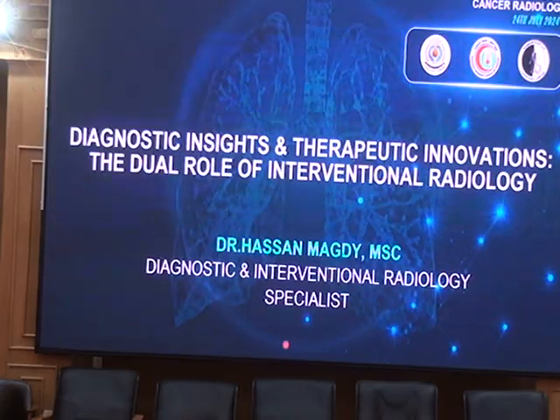But interventional radiology offers two more ways. I can either drill a small incision, like 5 mm or so, and grab a piece of it, or I can enter through the pipeline. This is interventional radiology. Either percutaneous approach, I go directly towards the lesion I target, or I enter through femoral or radial arteries through a vascular route and reach my lesion.